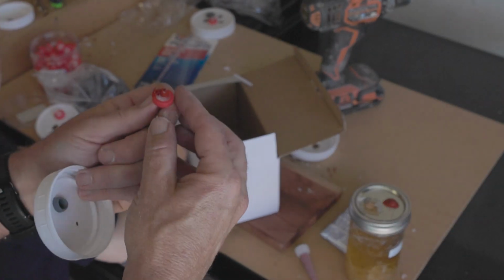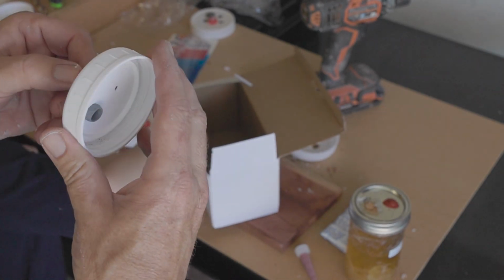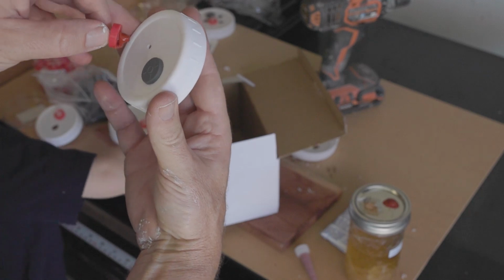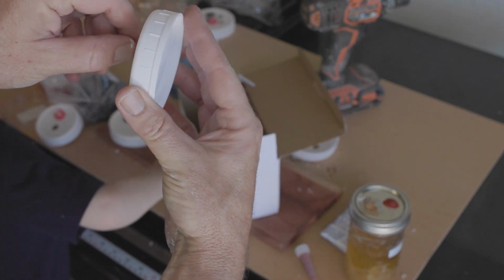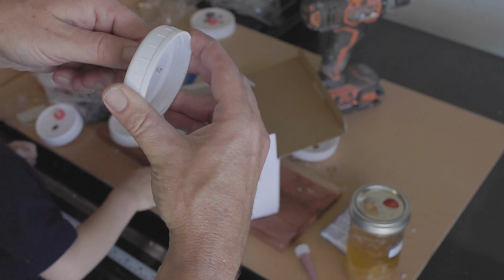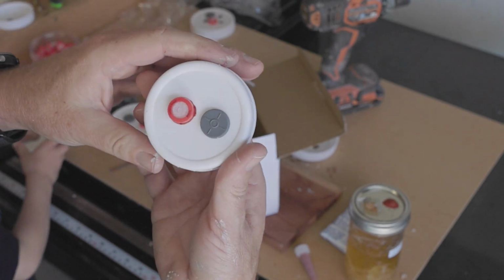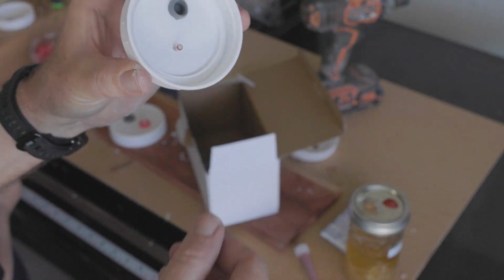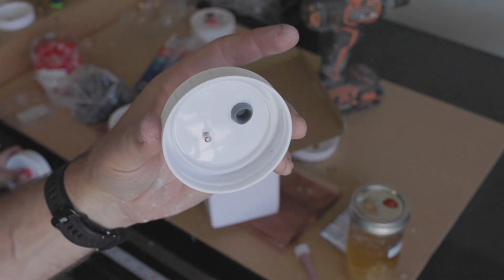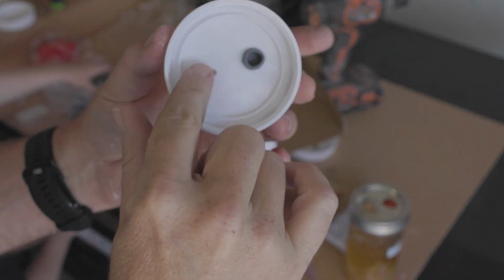That's a nail. It's supposed to not make it dry out, but it didn't work very well. All right, let's see. I'm gonna turn while I put it in, to make an extra seal. See, that squishes out just fine. Have anything in there? Yeah, I'm good. Oh, yes, a little bit of red.